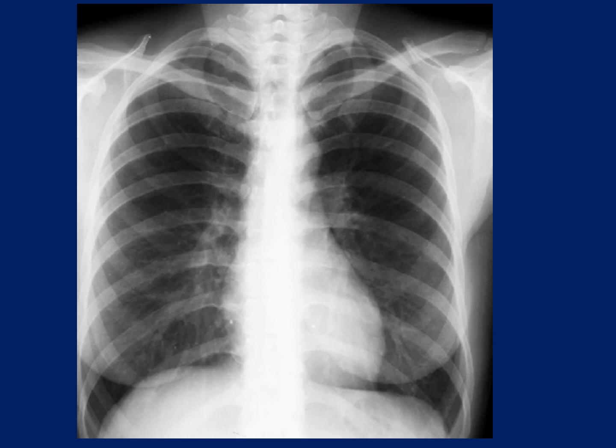Here's a nice x-ray here. Looking at this, on the left part of the screen, which is the patient's right side, the patient's right hemidiaphragm, whereas you're viewing it on the left, sits slightly higher. You can see the costophrenic angles here at the very bottom. They should be pointy at the very bottom of the picture.